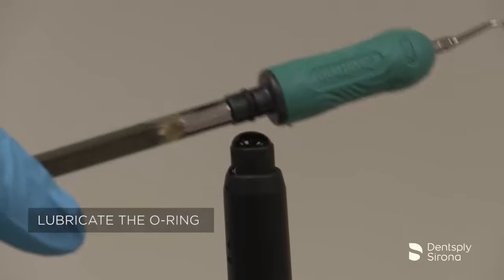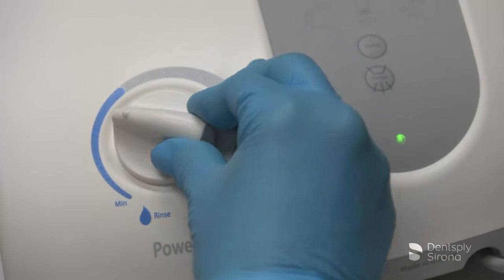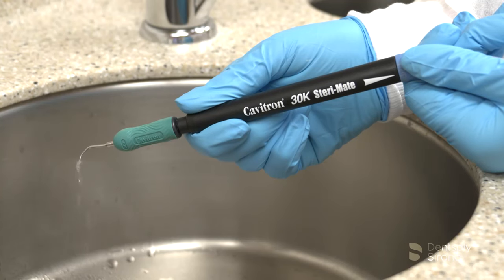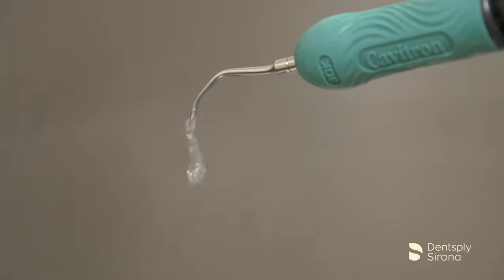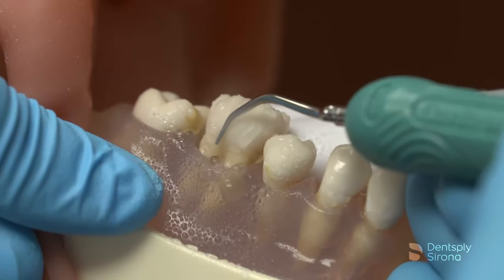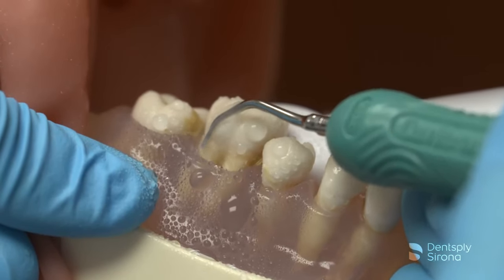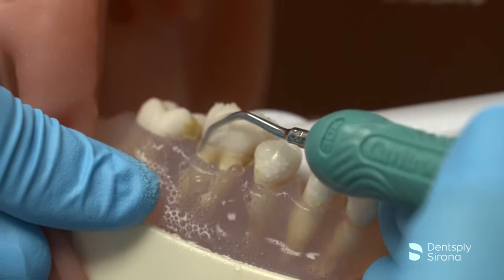After the clinician has filled the handpiece with water, seated the insert, selected the power, and adjusted the spray properly, instrumentation begins according to the treatment plan. The Cavitron FSI Slimline 1000 can be adapted at the line angles, the root concavities, and interproximally as well.